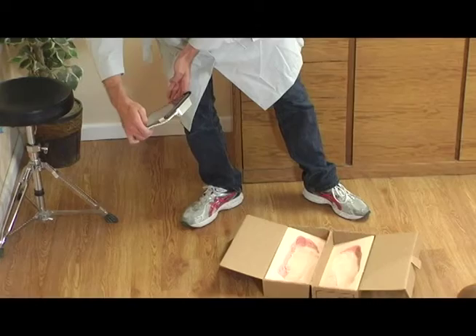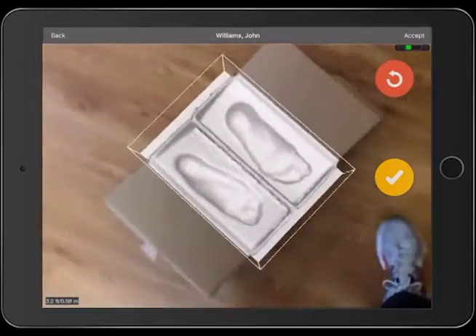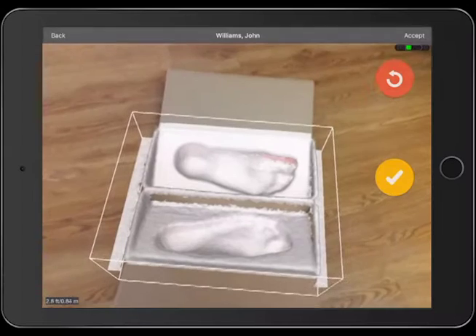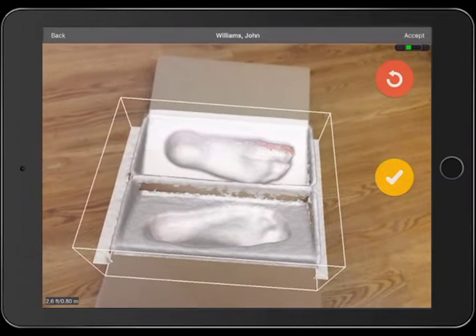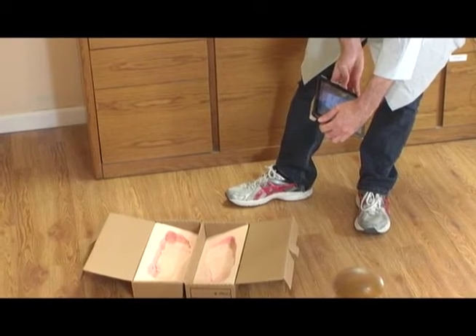Try to eliminate any holes or pink areas you see in the cast. You may need to hold the iPad still for a few seconds to completely fill in the holes.